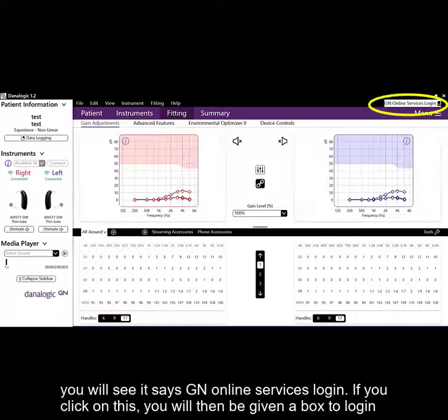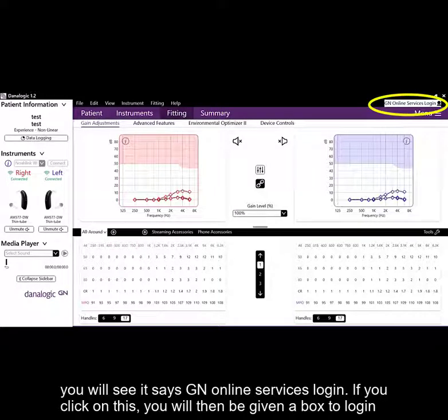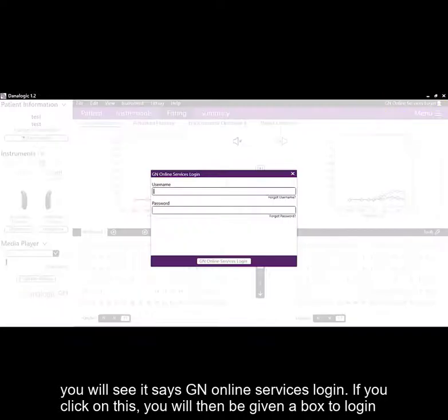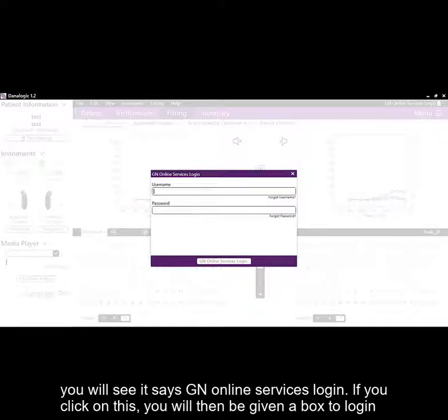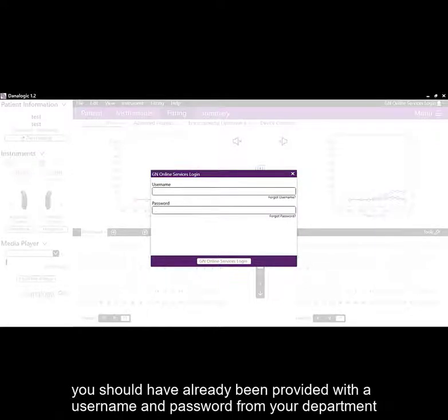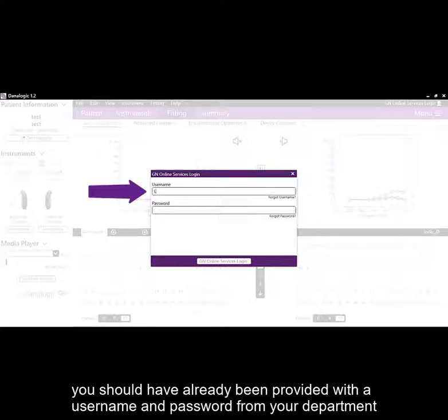You will see it says GN Online Services Login. If you click on this, you will then be given a box to log in. You should have already been provided with a username and password from your department.